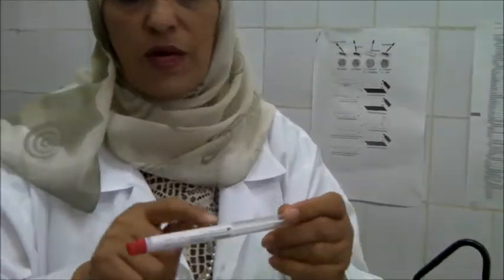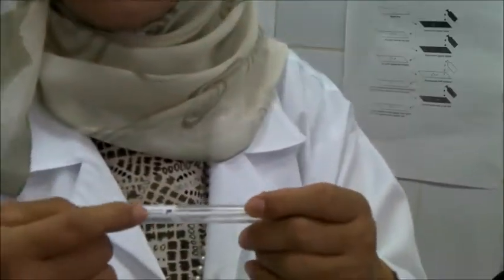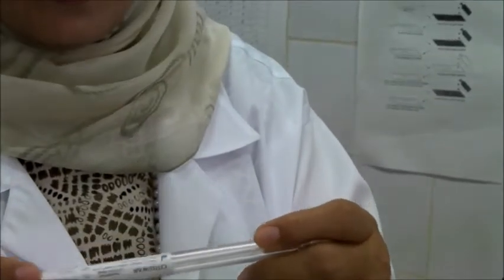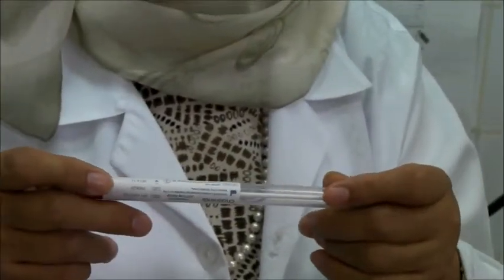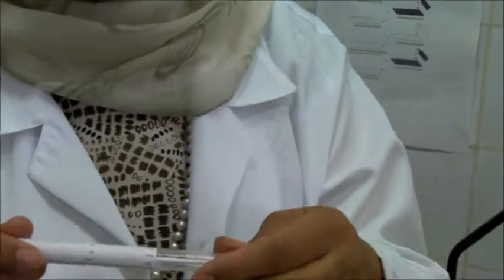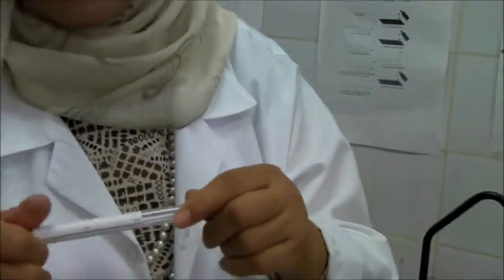Today's lab is about throat swab culture. Here we bring our throat swab. It is still disposable as you see, and it has a label where we will write the patient number, hospital number, patient name, time, and date of the sample collection.